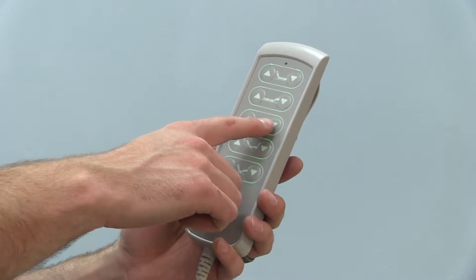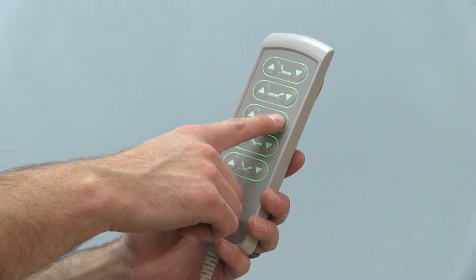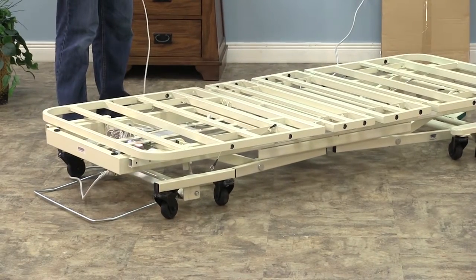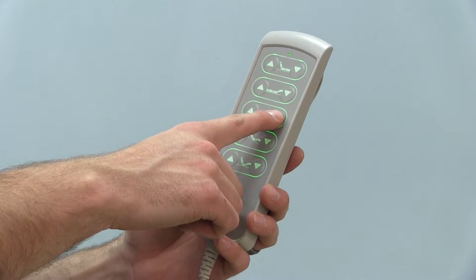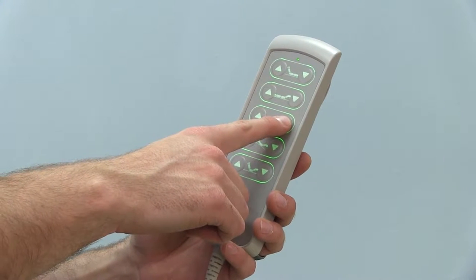Next, zero the control box and actuators by holding the elevation down button on your hand pendant until the bed is completely lowered. Continue to hold the down button for five seconds once the bed is fully lowered.